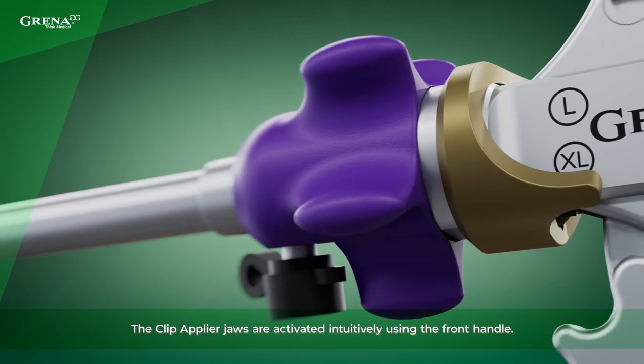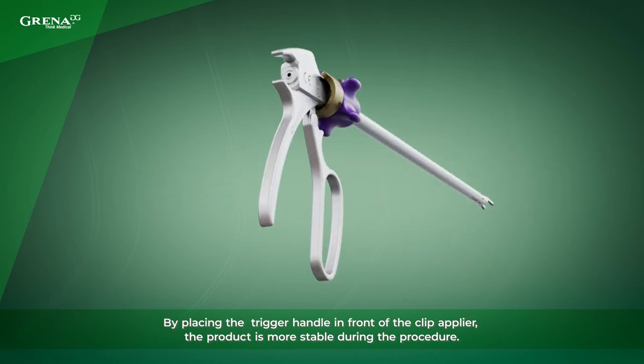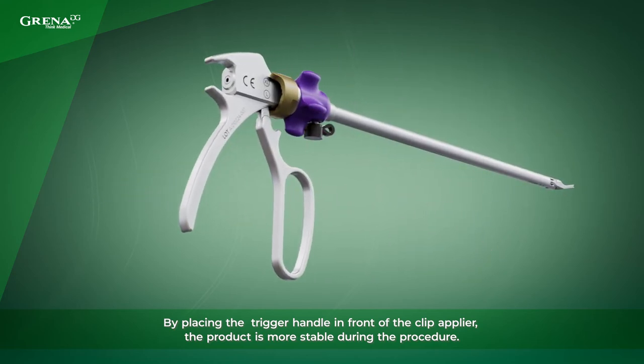The Clip Applier jaws are activated intuitively using the front handle. By placing the trigger handle in front of the Clip Applier, the product is more stable during the procedure.